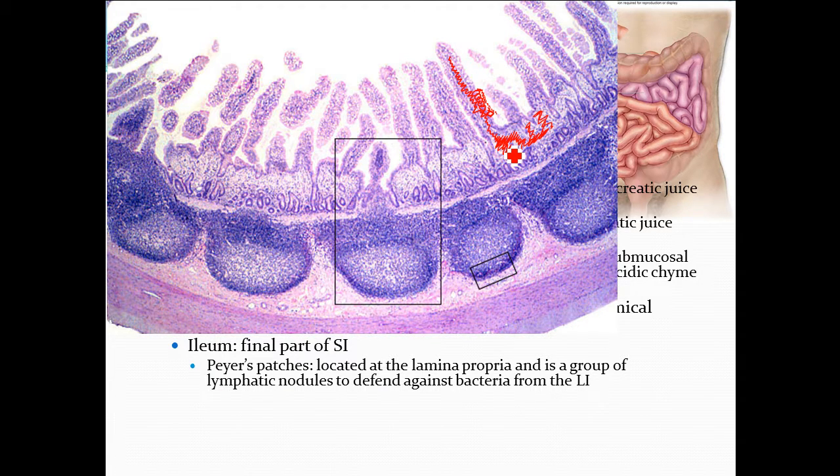What's underneath the epithelium? Okay, good. Connective tissue. What is that connective tissue with the other tissues involved at this location, though? Starts with an L. Yeah, the lamina propria.